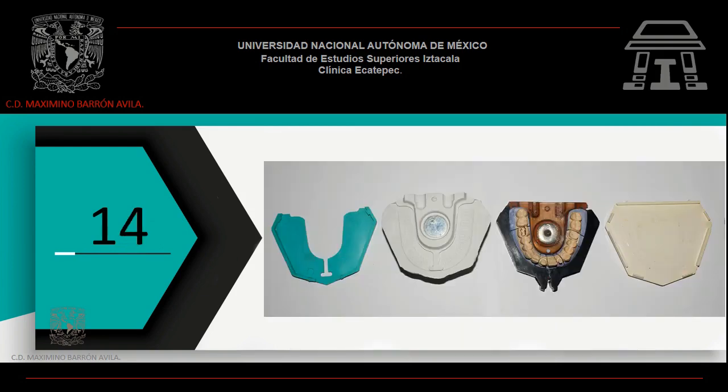Terminamos con la segunda parte: sección de modelos en troquel empleando el sistema ACUTRAC. Para la realización de la práctica se requiere material de impresión, así como yeso, y contar con el sistema ACUTRAC.